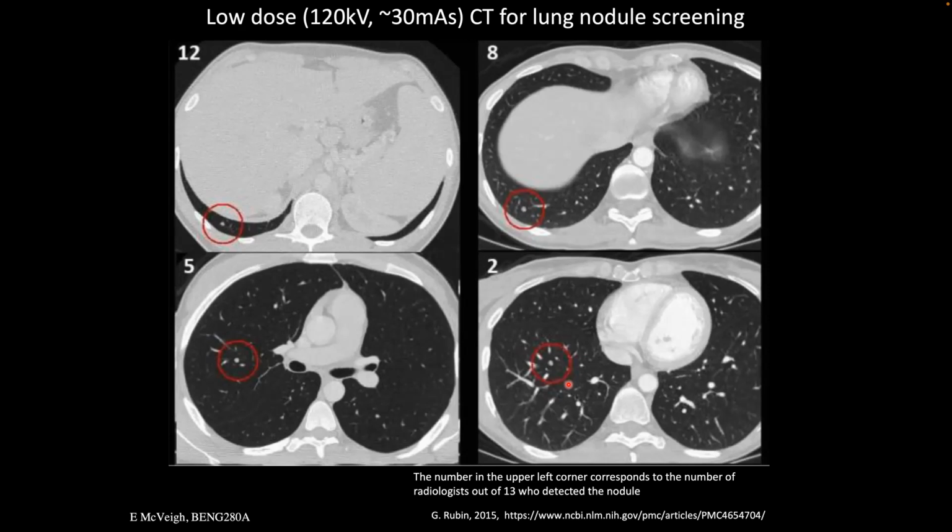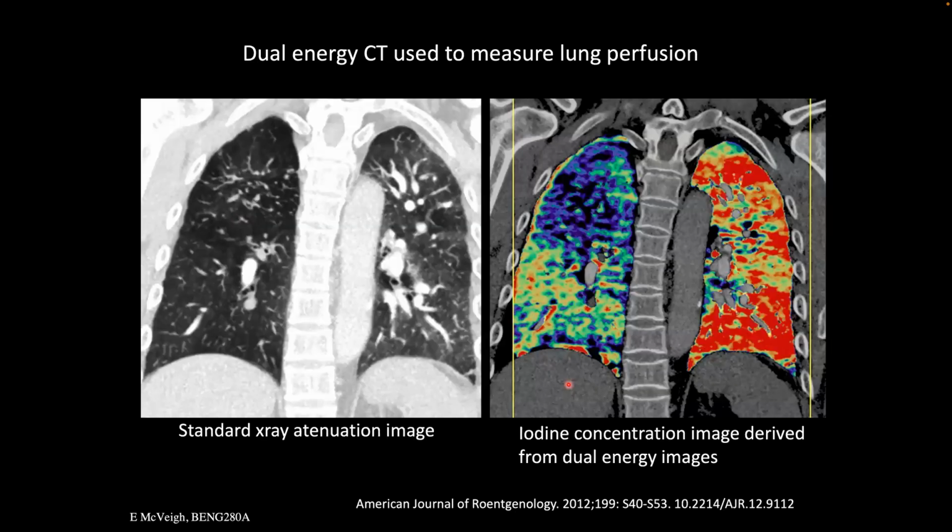And so that's how both screening for lung nodules and also mammogram screening is AI, and mammogram screening is a big application as well. You can imagine that AI in pathology. I don't know if any of you have watched how pathologists work, but my God, they're looking at huge fields of views of cells, looking for particular signs in these cells. And so again, that's a great thing for a machine to do. So I think on the horizon, all of this will improve a lot as machines get better at being the primary screening doc.